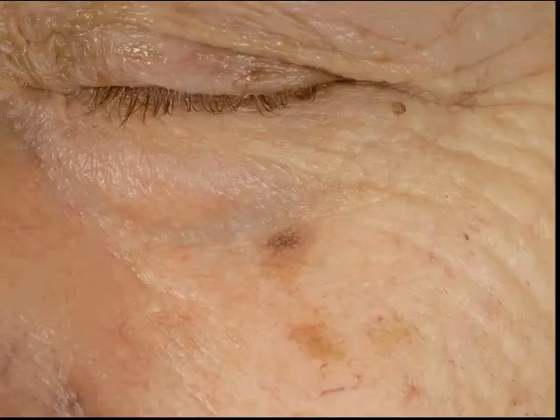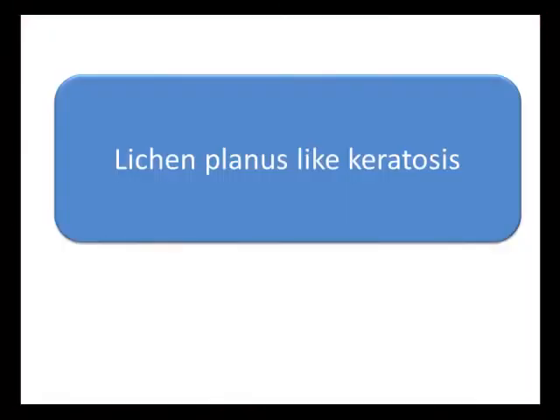Here is another case — clinically difficult. No circles, but dots, and the dots are gray, and the pattern of dots is interrupted by hyperpigmented follicular openings. This could be everything: melanoma in situ, pigmented actinic keratosis, or lichen planus-like keratosis. So if there are no circles, you can't tell. In this case, it was a lichen planus-like keratosis.